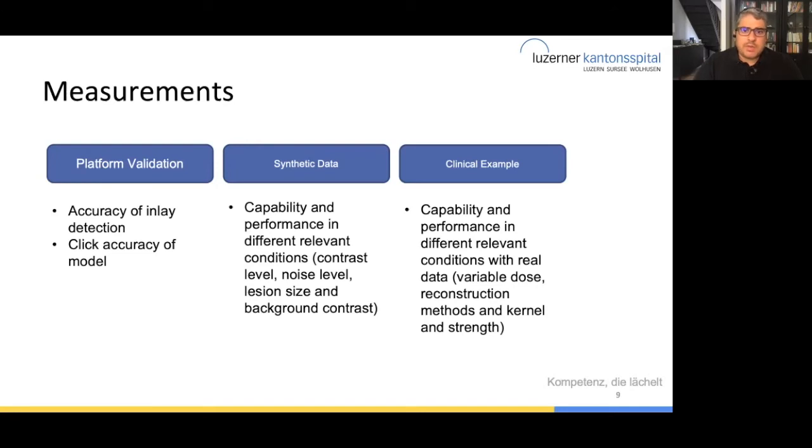Since we trained 5 different models on each different fold of the dataset, we could use cross-validation for this step. Each individual model is evaluated on its validation set. We furthermore extract the learned parameters alpha and beta for individual observers, and all validation steps were performed on unseen labeled data. The model performance was evaluated versus its human counterpart. Lastly, we evaluated the capability and performance of the model versus synthetic data, which provides a control of relevant conditions, and against real data.